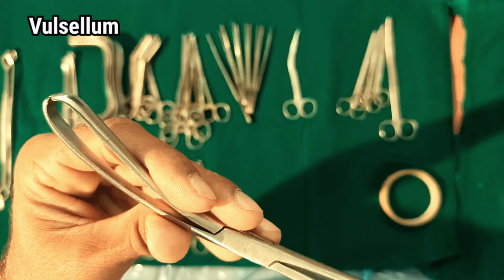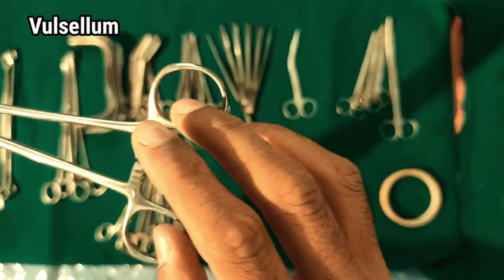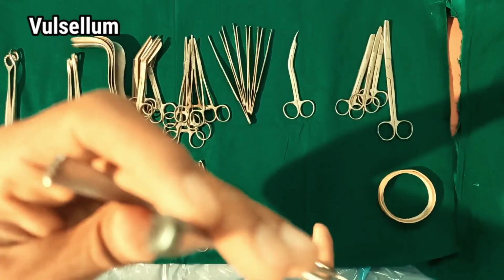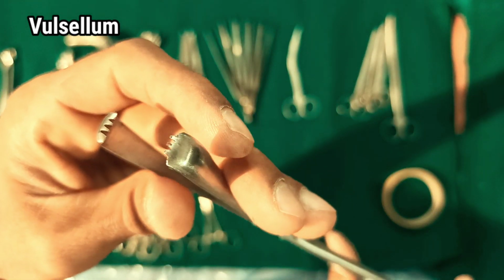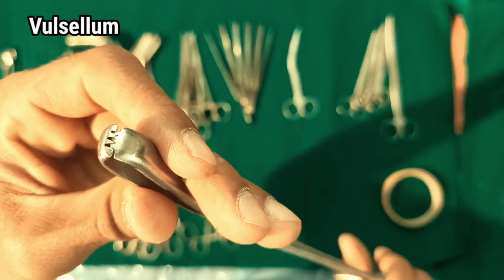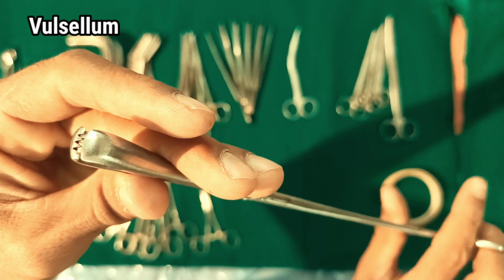Vulsellum. Vulsellum forceps are used in obstetrics and gynecology. Each pair of surgical forceps has a hook at the tip of each blade and is used to grab the uterus or cervix during procedures.